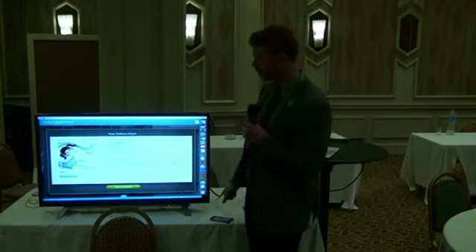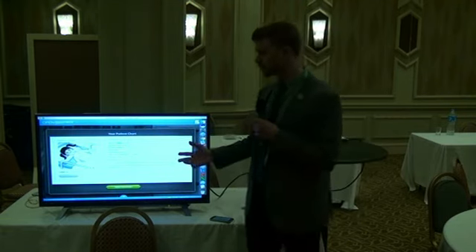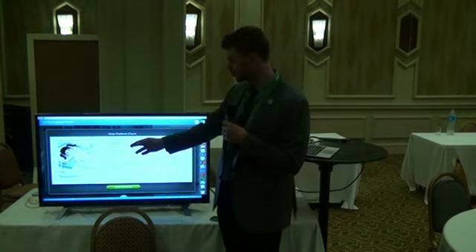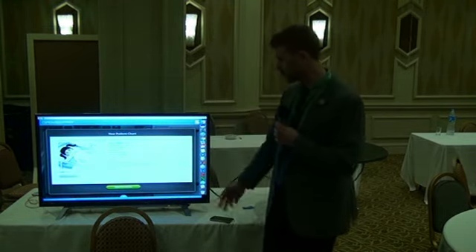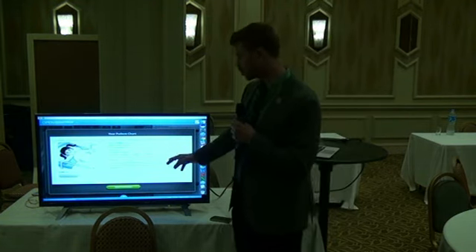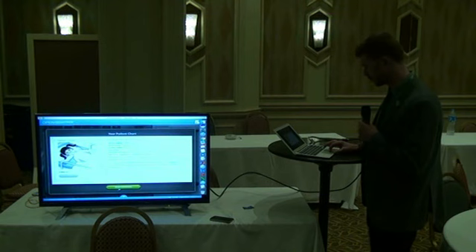Okay, so what we're going to do is step through a couple of cases right now. This is really how the virtual ventilator works: you're presented with a little bit of a patient history. So this is obviously not a baby, but a 6-year-old girl with some pigtails, and she's admitted to the pediatric ICU, and this is what we know about her. She's in the PICU for pneumonia. She was intubated, obviously pretty sick to require intubation, and we're called over to the bedside by the nurse, who noted that the patient's oxygen saturations had decreased.